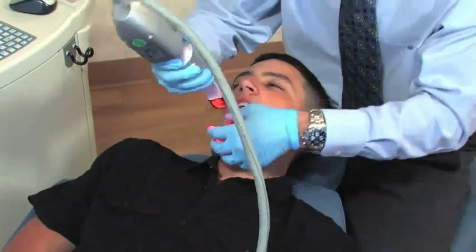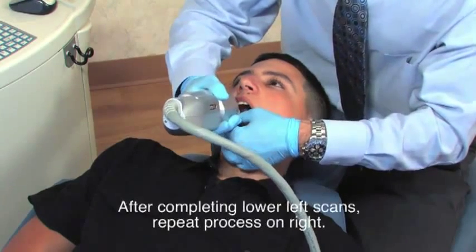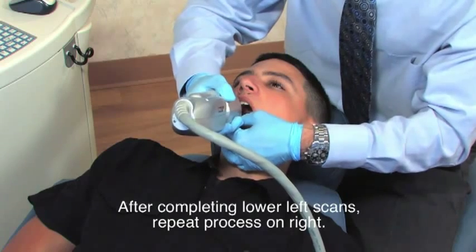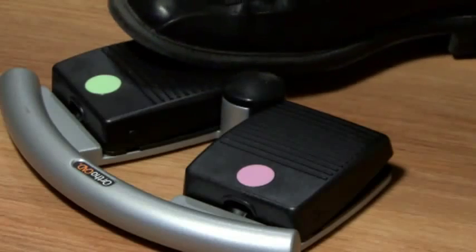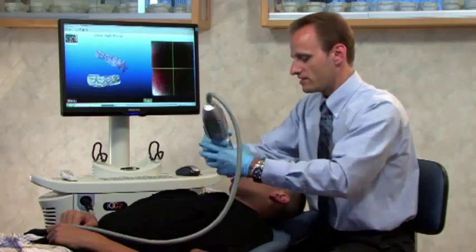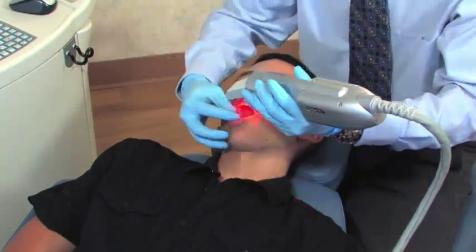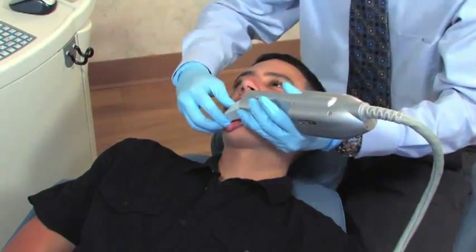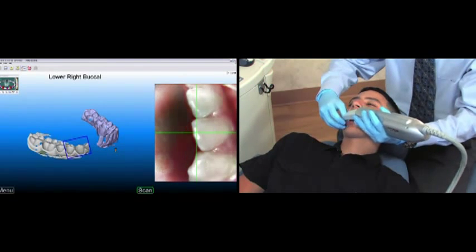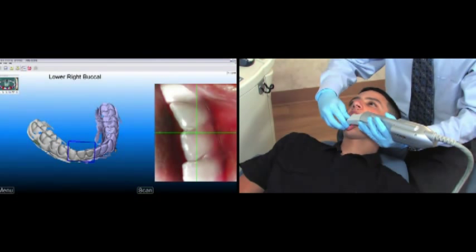Now we'll scan the right side. Repeat the process on the right side, beginning with the occlusal view and rotating to the buccal, moving one tooth at a time and pressing the green foot pedal to take a scan. As I get to the anterior on the right side, it might be easier to switch hands when holding the scanner. As we fill in the lower right scans, the IOC scanning software stitches the two quadrants together at the midline.